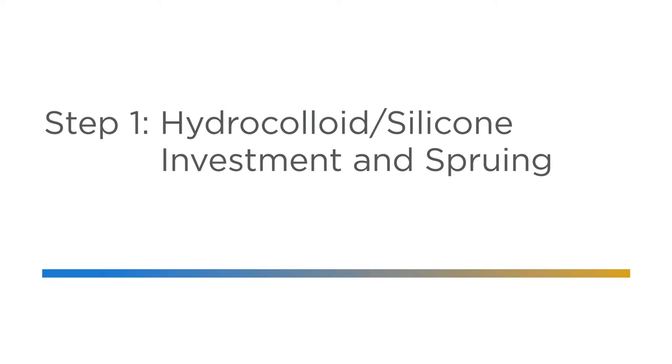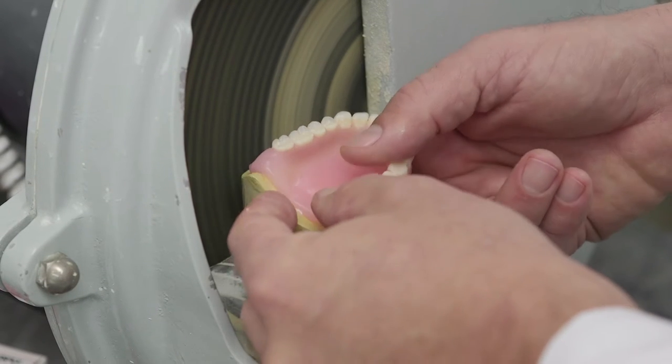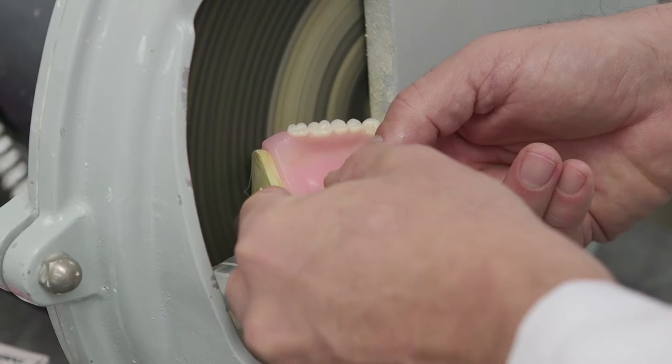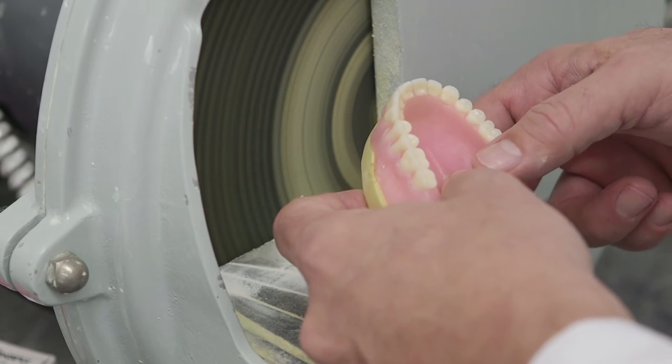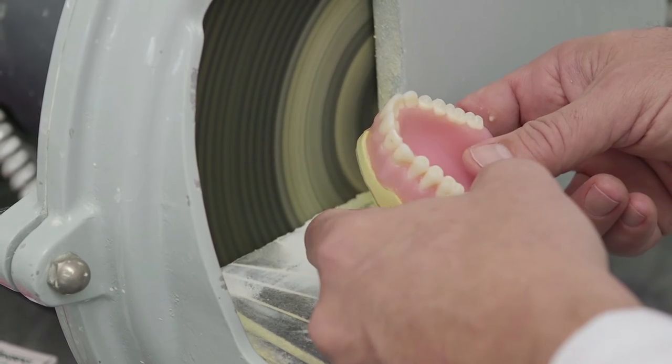Step one is the preparation of the hydrocolloid silicone investment and sprueing. First, incorporate a slight taper into the base of the cast to facilitate removal from the mold material. Incorporate the taper so that the base is the widest.